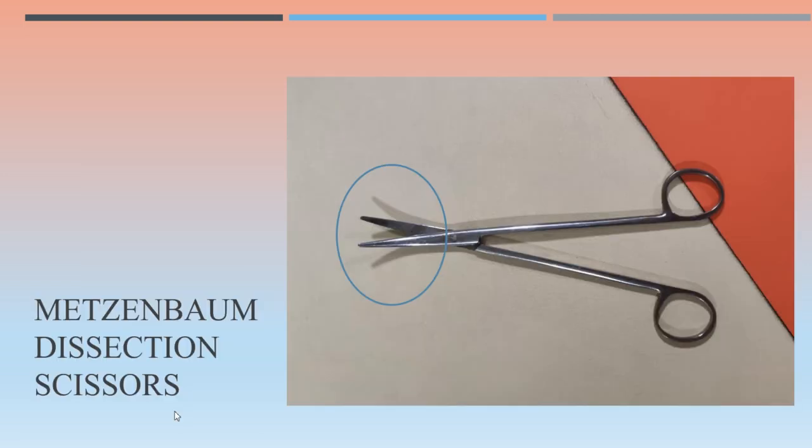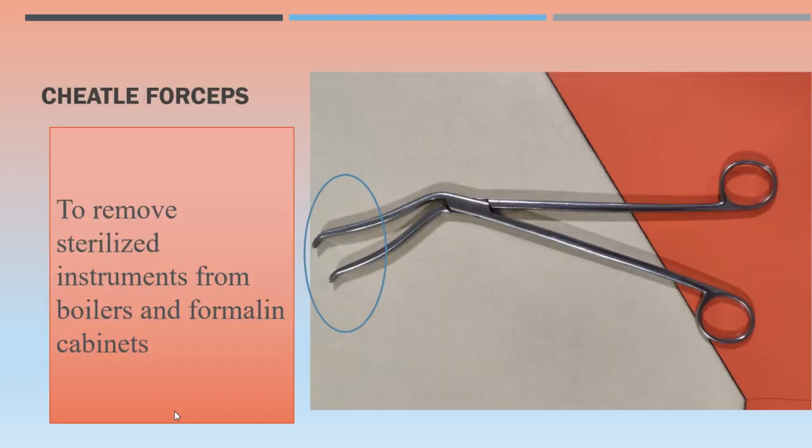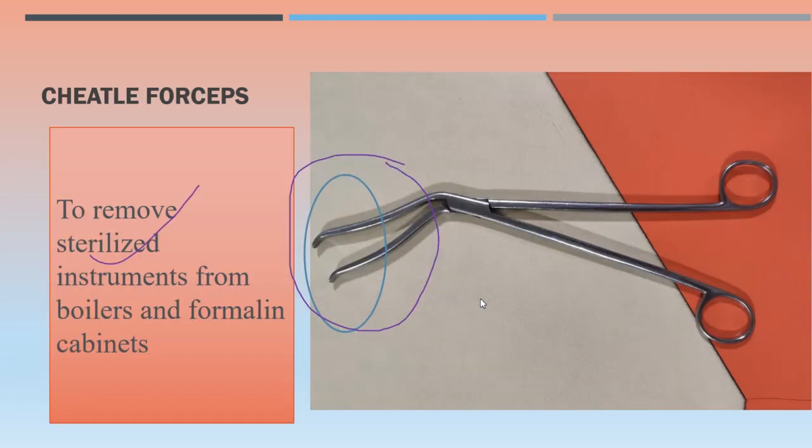Next, Metzenbaum dissecting scissors and Roberts artery forceps — we have already covered these, just revising. Then Cheatle forceps — you can see the angulated distal end. It is used to remove sterilized instruments from drum boilers and formalin cabinets. This distal end is used to take out sterilized instruments. Cheatle forceps is usually seen in the wards on dressing trolleys.